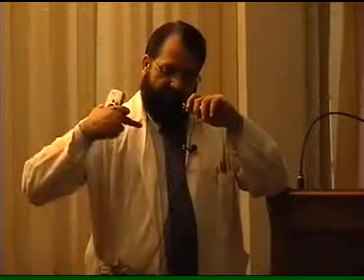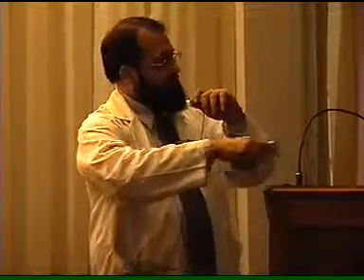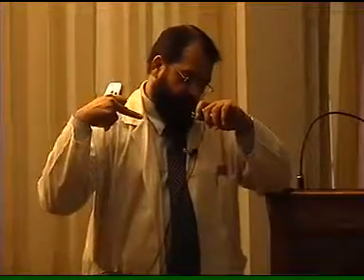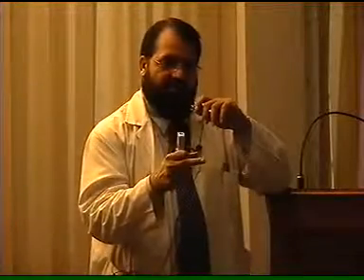For example, if you draw a clock face, the cardiac vector is from the 11 o'clock position towards the 4 o'clock position, from the right arm going to the left leg. The leads looking from this side, the inferior leads, will register the cardiac vector as a positive deflection.